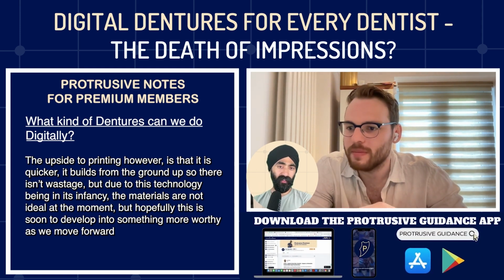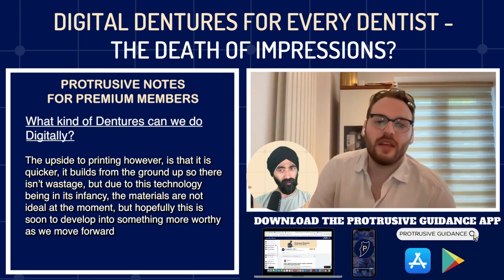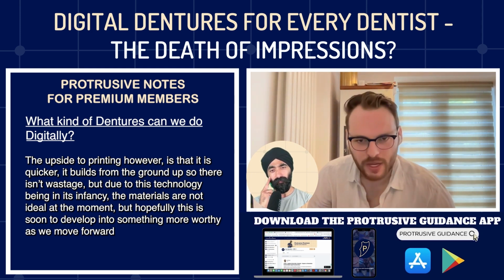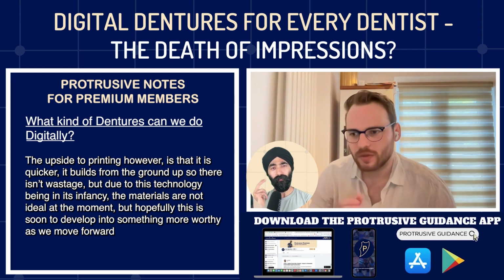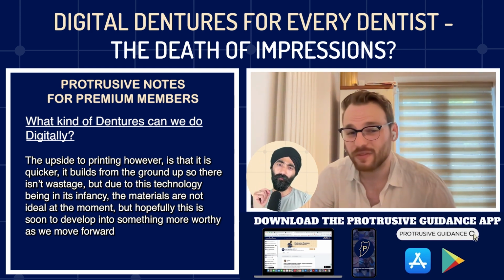So we're limited to resins, right? Or, the traditional acrylics we use would be different to what we can print. Yeah, so there's a material called Lucitone from Dentsply, which seems to be the one that's sort of leading the charge at the moment. We've had a play with it. It's not quite there yet in our hands, but we've only done it for partials. It seems to work better for completes.